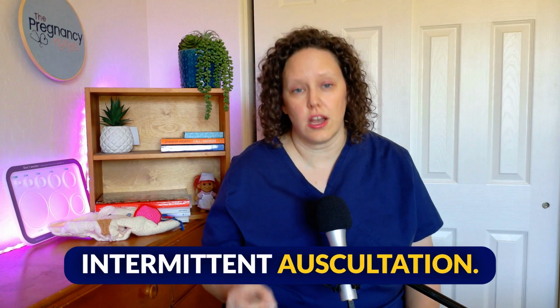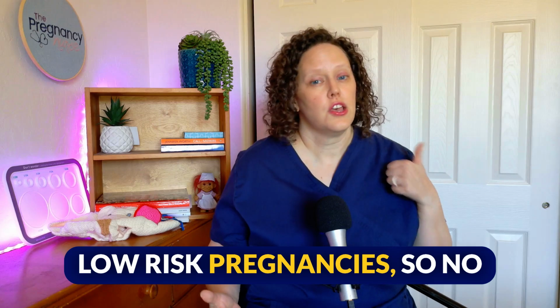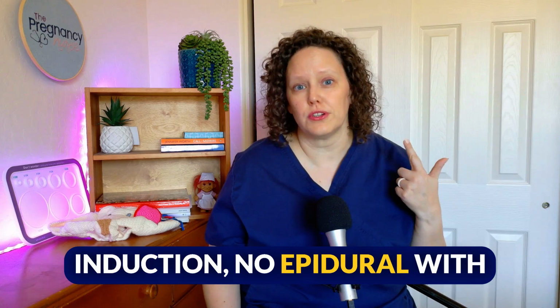Stay tuned. There's another way that we can monitor you during your pregnancy, and it's called intermittent auscultation. I have a whole video about it that you guys should totally check out if it's something that you're interested in. The pro tip that you need to know is this is really only for very low risk pregnancies. So no induction, no epidural with intermittent auscultation. Sometimes in the very early stages of an induction, you could use intermittent auscultation, but once you get Pitocin, intermittent auscultation is off the table. You do need continuous monitoring.